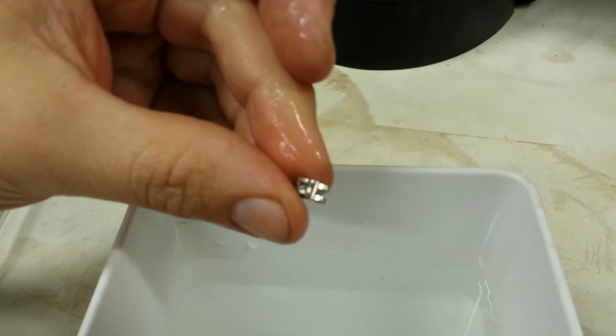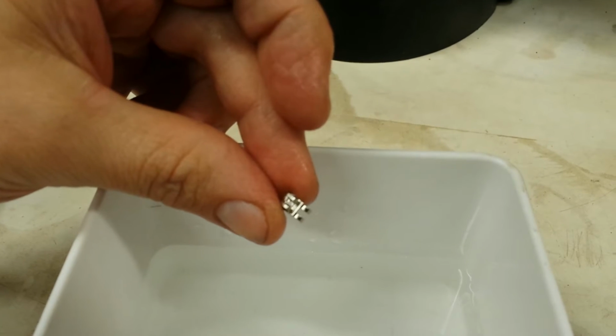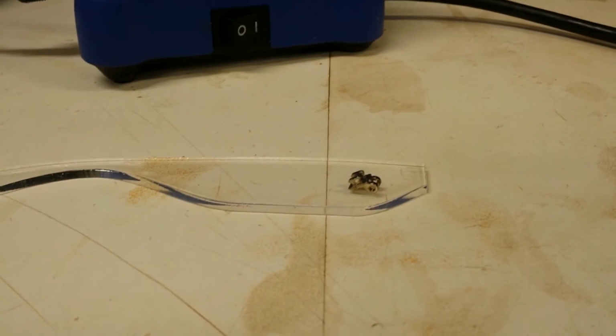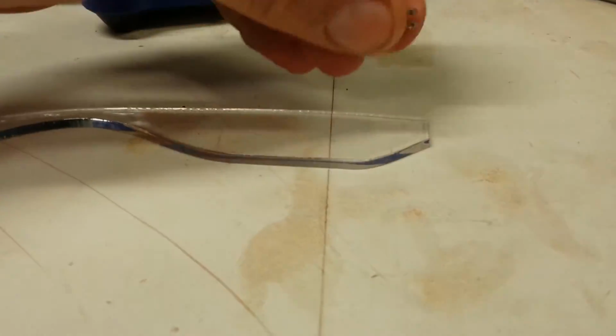My plan is that when I make my new hinge, I'm going to try and put it in with a soldering iron. So, there you go. Okay, so I don't actually know if this is going to work or not, but I'm going to try it. What I'm going to do is I'm going to take this little piece right here. You can see my laser cut piece of acrylic here. And I have a hot soldering iron.